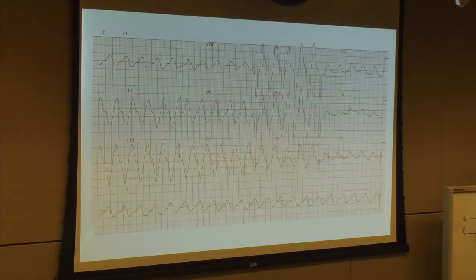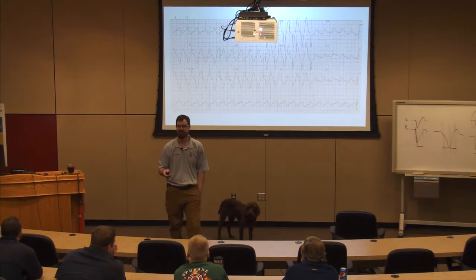Is there any kind of an indicator there also? You mean notching in the downslope? Yes. The times where notching in the downslope is really beneficial is when you're trying to distinguish SVT with a left bundle branch block from VTAC.